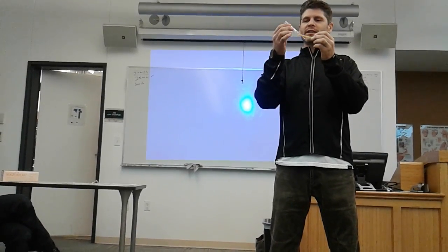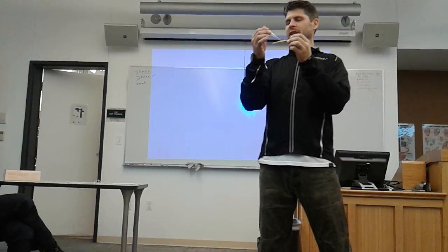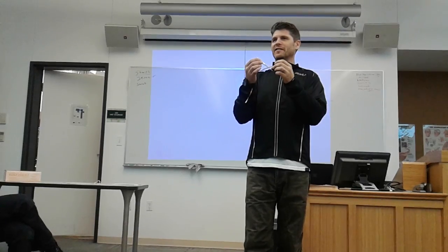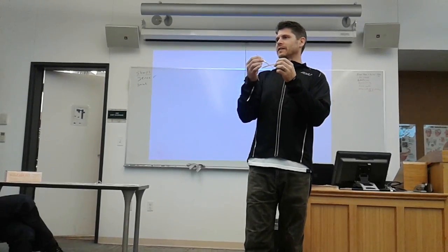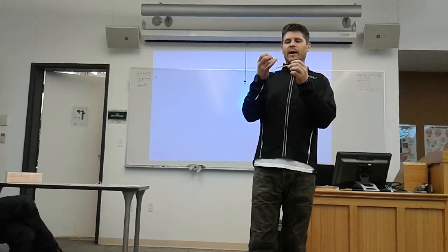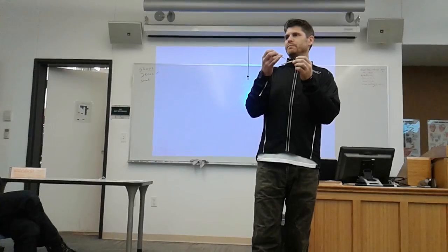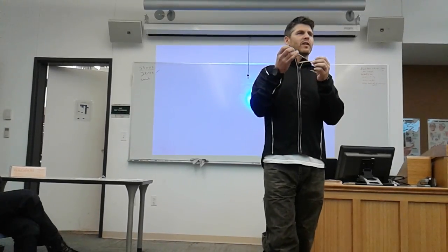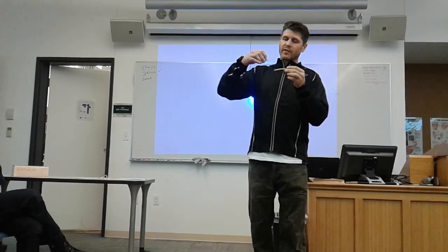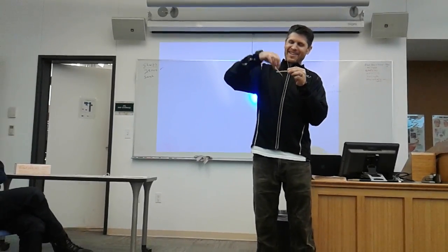Every time you move it from wherever you are, you're just pushing tissue around. And if you're beside the vein, you're just pushing the vein to the side. It's not helping you at all. Get yourself back into alignment. So when you redirect, bring yourself back out, redirect, and then go back in. Does that make sense? Also make those movements a little bit slower and more deliberate.